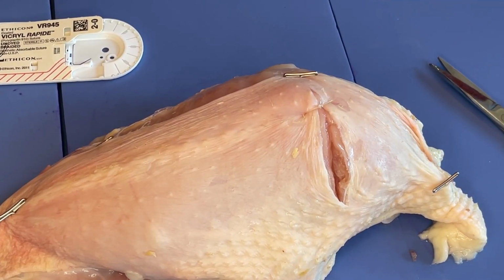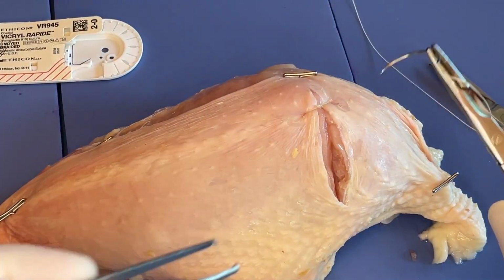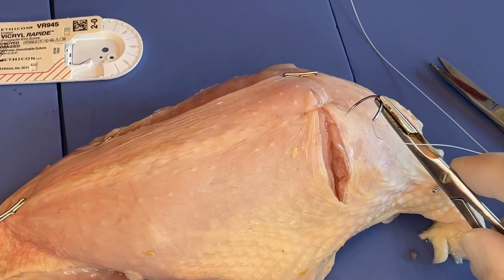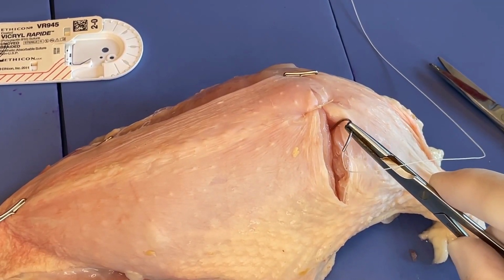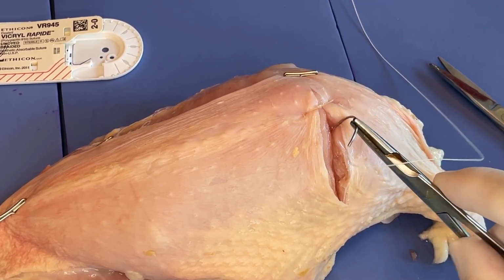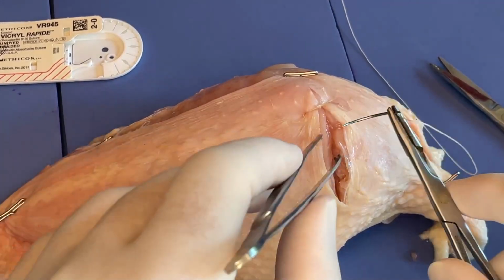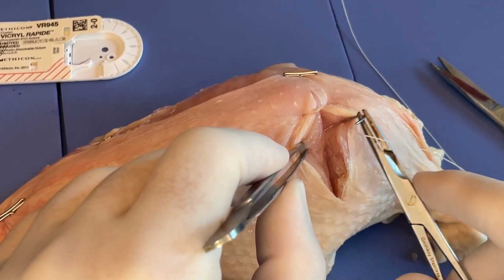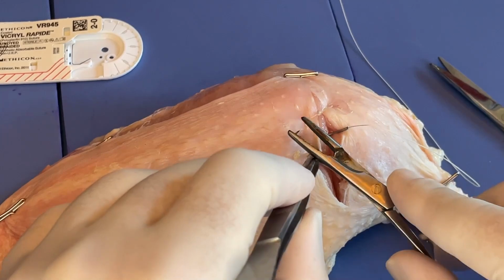One of the things that we oftentimes talk about is burying the knot. So if we don't want to have the knot kind of sticking out above the skin, we can bury it. The way we do that is, instead of starting on the outside of the tissue and then popping out down here on the inside, so kind of going out to in and then in to out for our second bite, what we would do is we would start on this opposite side and start here and go in to out, so to speak.